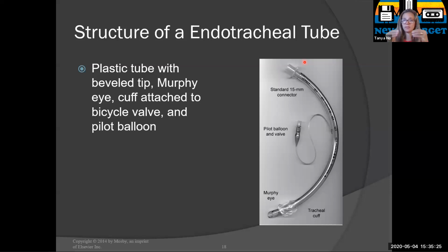They usually have standardized connections for any ambu bag, inline suction catheter, or ventilator circuit. And the 15 millimeter connector should fit inside a 22 millimeter connector. They're just two common sizes that we use that help us fit most connections, okay?